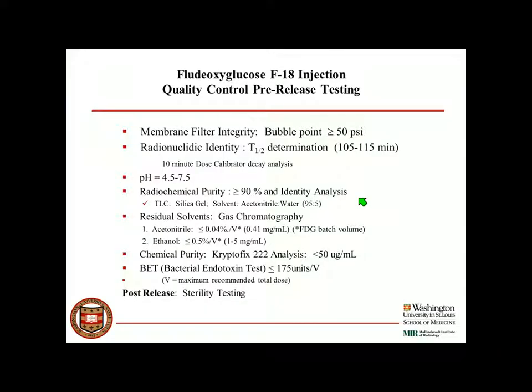Once we finish producing this, we bombard for 2 hours, we bring the activity out of the target, and we then run through shielded lines under the floor up to our hot cells. All of this is done in hot cells because the amount of activity that has to be handled can't be handled manually unless you're using remote arms. But all of our modules run again.